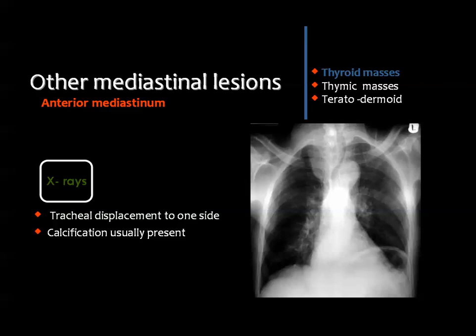And we started by the anterior mediastinum, and we have the three, and sometimes I consider four, the three pathologies which start by the letter T. And number one is the thyroid mass extending into the superior mediastinum, retrosternal extension, the thymic tumor, the teratodermoid tumor, and the fourth one is known as the terrible lymph nodes, which are due to actually lymphoma. Then let us discuss these three issues, starting by the first one, which is the thyroid extending retrosternal.